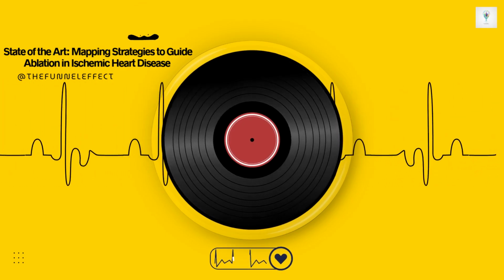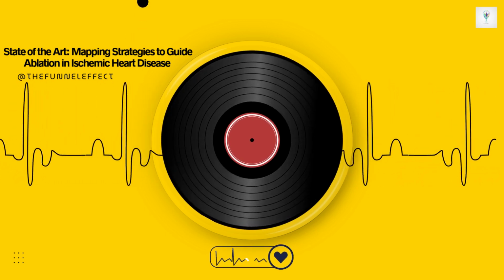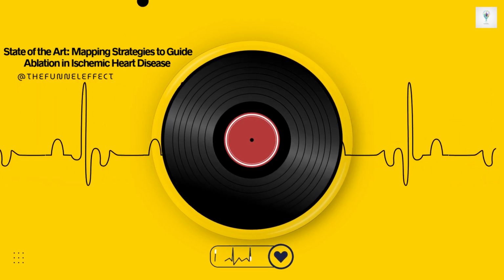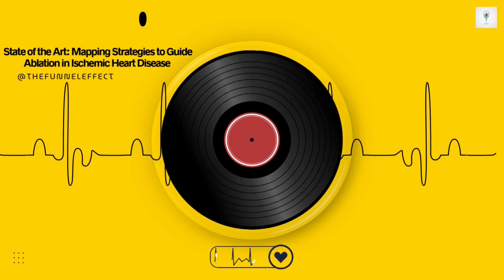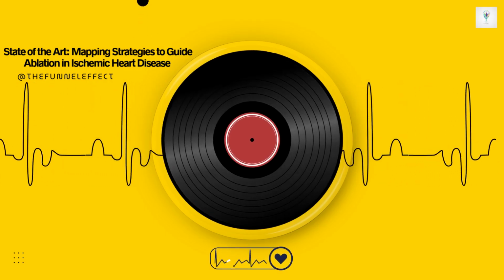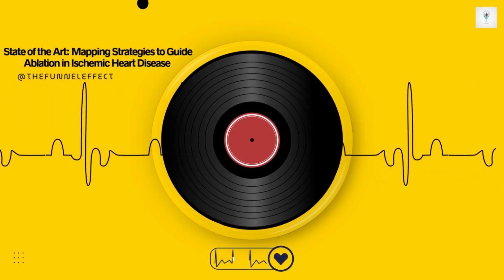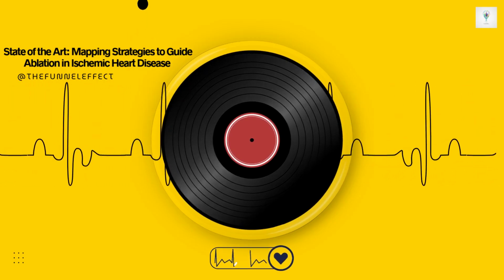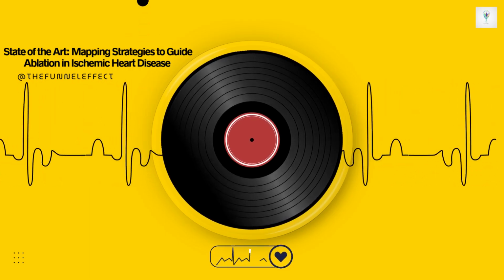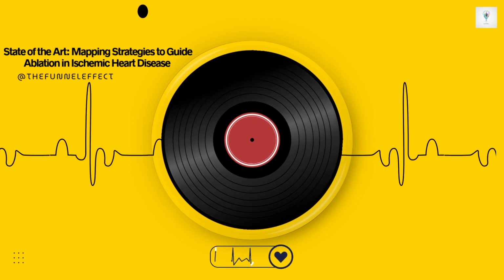It really highlights the specificity of finding these crowded areas. Interesting. You mentioned earlier that the extent of the slow zone you map can depend on where you pace the heart from. Why is pacing from different spots important for ILAMs? Yeah, that's key. Think of the scar as a complex, rocky landscape. The path the electrical wavefront takes through it and where it slows down the most depends on the direction it approaches from. If you only pace from one spot, say the right ventricle, the wave hits the scar from one angle, revealing certain slow pathways. But if you then pace from a different spot, like the left ventricle, the wave hits the scar from a different angle and might reveal different slow conduction zones or make the previously seen ones look larger or smaller.